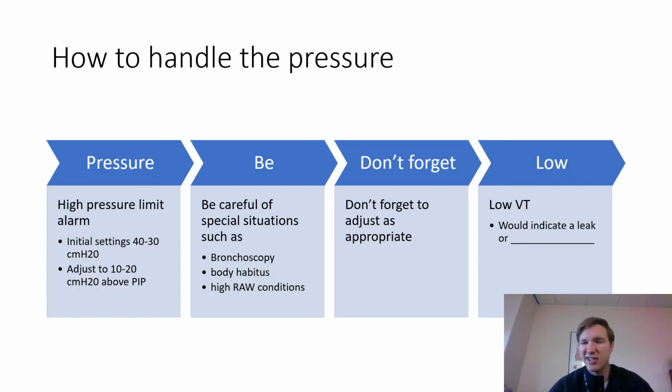So hopefully that exercise was a little helpful going through what alarms would go off in there. Now, one of the things that we'll try to do in lab is to simulate some of these and get you some practice with, okay, what do I do with this alarm and what's the appropriate procedure, which ones are high level and so on. So we'll try to get you that functional use of it.